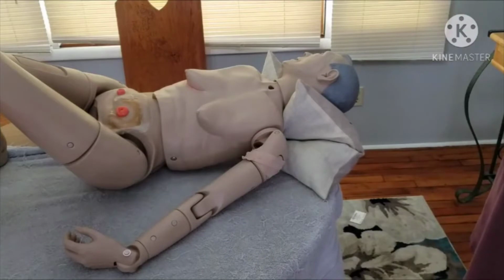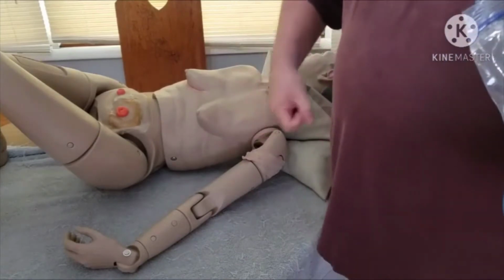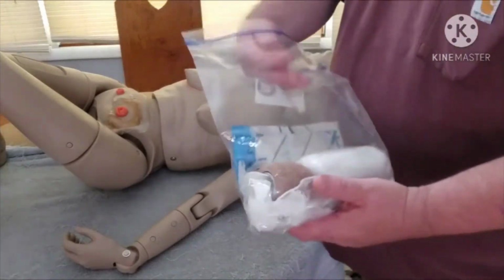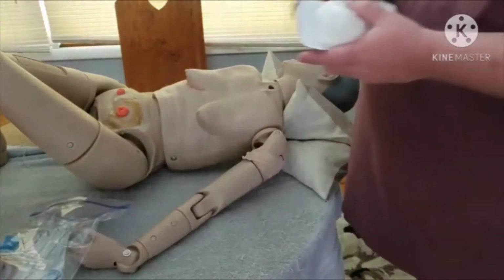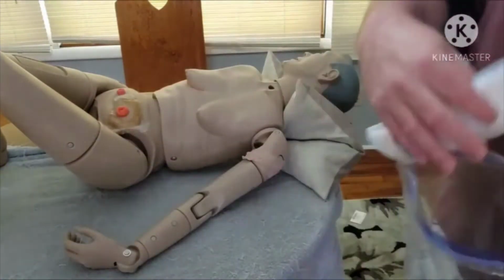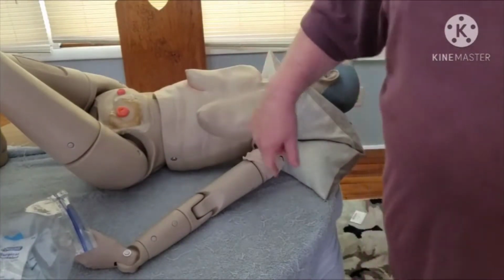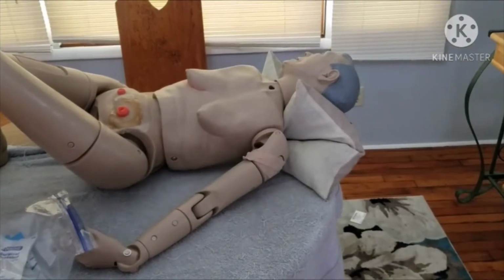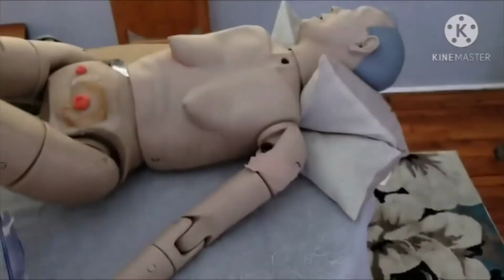Now, the ideal thing to use for packing a wound is hemostatic gauze, which is gauze that's been impregnated with an agent that promotes blood clotting. And if you don't have that, and if you have one of our Amcon medical kits that we provided, you have Kerlix gauze in there, and this can also be very effective. The clotting factor helps, but understand the main purpose of packing the wound is to get pressure down there where you need it. So it's more important, the mechanical action of packing, than the actual gauze that you're using.